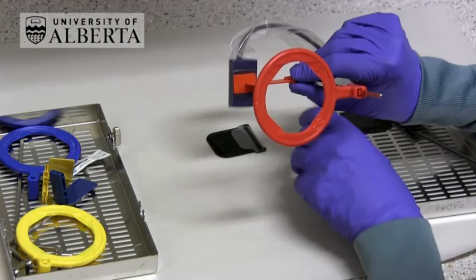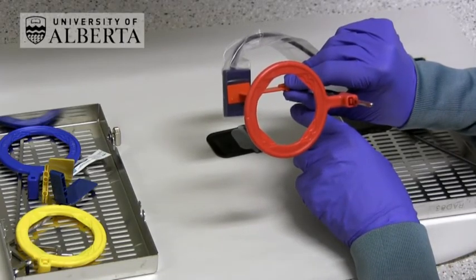Always make sure that the patient is closing completely together onto the bite block before making an exposure.